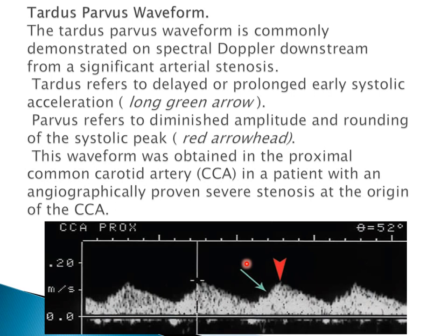Yes, up. That's the thing. It's slowly increasing and slowly decreasing. Slow upstroke, increasing, and tardus parvus. Okay?